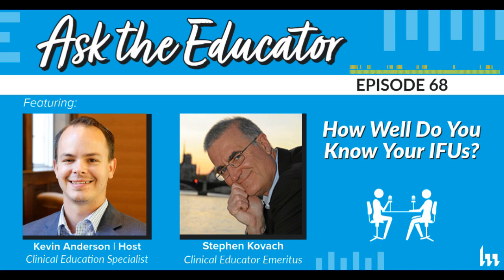Rongeurs are really tough. People talk about rongeurs and they're always dirty and so on. So I pulled up a known company's IFU, and they talk about when it goes into the ultrasonic cleaner, the jaws are in the open position in a wire mesh basket. Well, we know that people do not have their rongeurs in an open position the majority of the time. It talks about cleaning and so on. We now know that there's the take-aparts, and that's probably the way people should go.